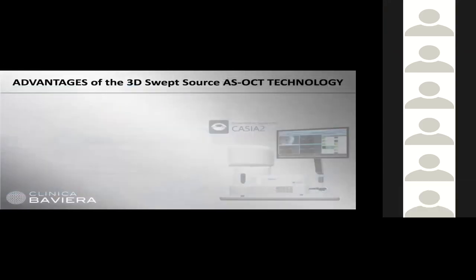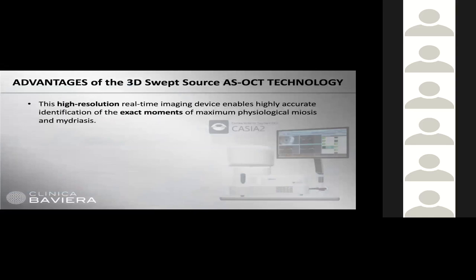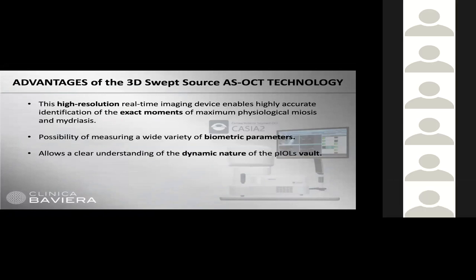And to achieve this, we can assist ourselves with this type of swept-source anterior segment OCT technology. This device provides high-resolution real-time imaging, enabling accurate identification at the exact moment of maximum physiological miosis and mydriasis. We now have the possibility of measuring a wide variety of biometric parameters, and this is very important. They allow a clear understanding of the dynamic nature of the ICL's vault.